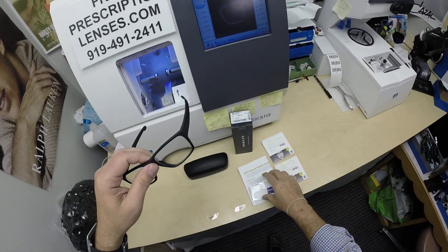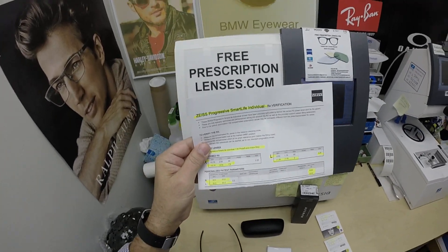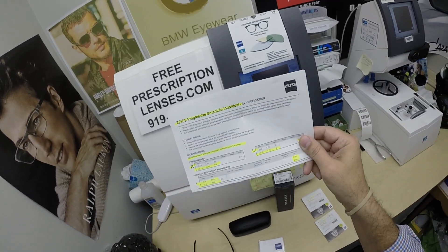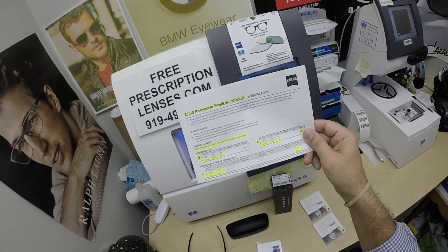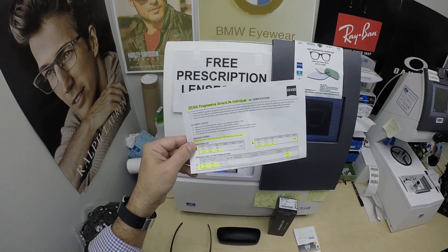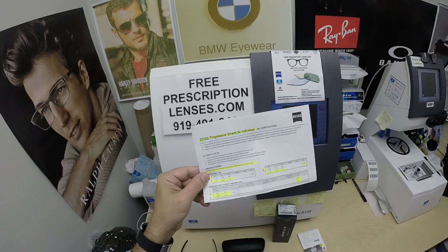Now he got the Zeiss Smart Life Individual progressive lenses. There is none better — this is the top of the line premium progressive lenses. It adds $299 to the purchase. Now for all you single vision people, you're thinking that's a lot. But once you're above 40 and you move up to a progressive lens, I'm selling that lens at $299, which is about half price of what everyone else offers.